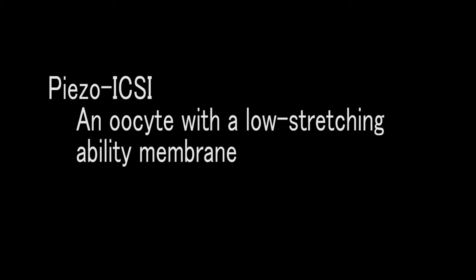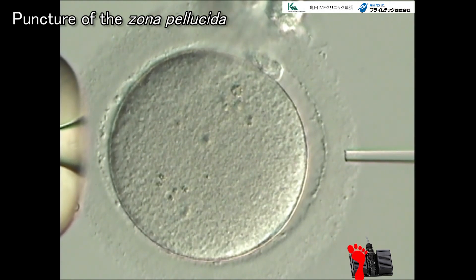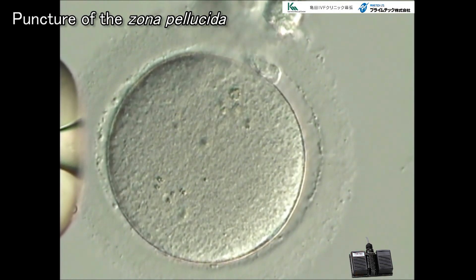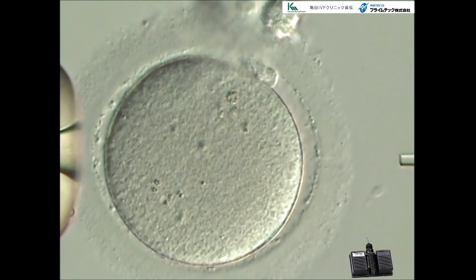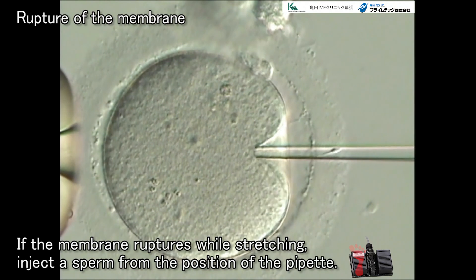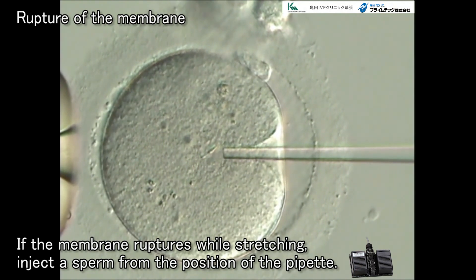We'll now explain how to deal with an oocyte with a low-stretching-ability membrane, which may get ruptured during the stretching. The action is the same as the previous one up to the point of stretching the cytoplasmic membrane. If the membrane is ruptured during the action, inject the sperm from the current position of the pipette without pushing it further forward. After the sperm is surely injected into the cytoplasm, pay attention not to add unnecessary liquid.